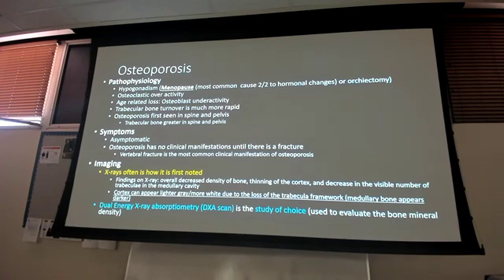It's not looking for fractures. It's a really fuzzy kind of picture, and you can't really read or dictate it that well, but what it does is it spits out a number, and it averages the density of the bone compared to a healthy patient of similar age, sex, race, and all of those factors. So those are important. And then it tells you whether or not they have decreased or increased bone density.